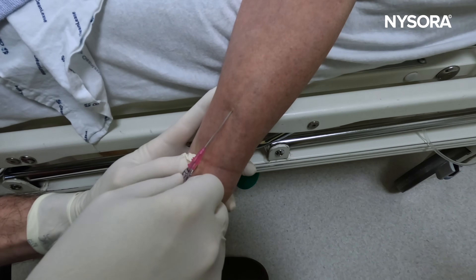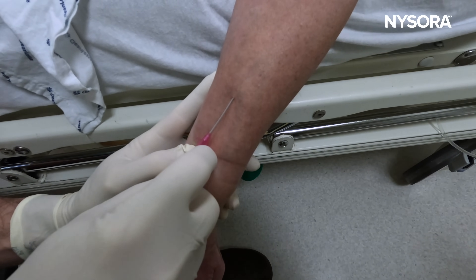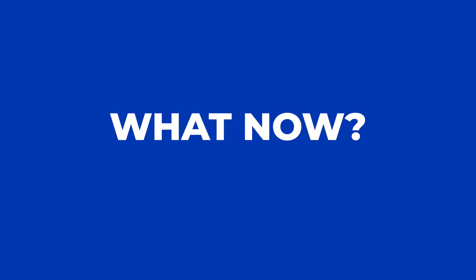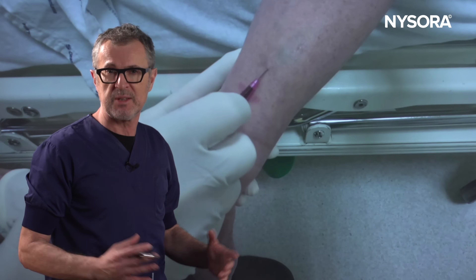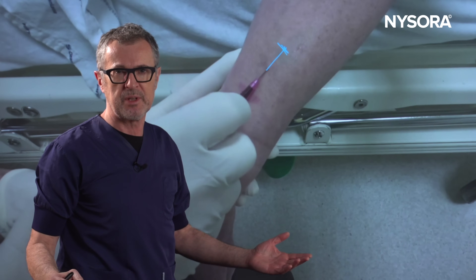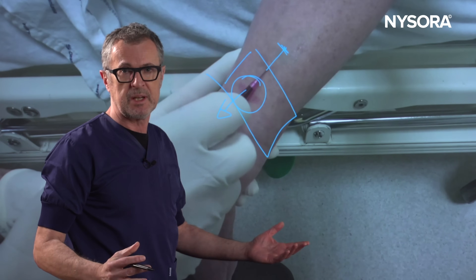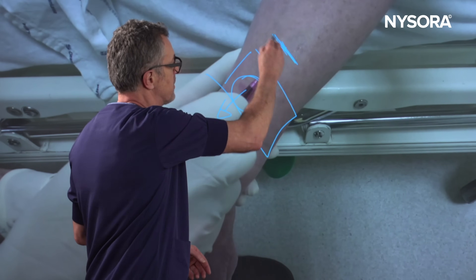I want to tense this. Here we're hitting the wall up here. So here's a common scenario: we have successfully inserted the catheter into the vein, but we cannot advance the catheter because the tip appears to be hitting a valve somewhere up here. We can see there is blood return from that particular vein, so we are inside, but it is not ideal to tape the catheter here instead of inserting it further. Every time we try to insert it, we hit an obstacle — the valve.